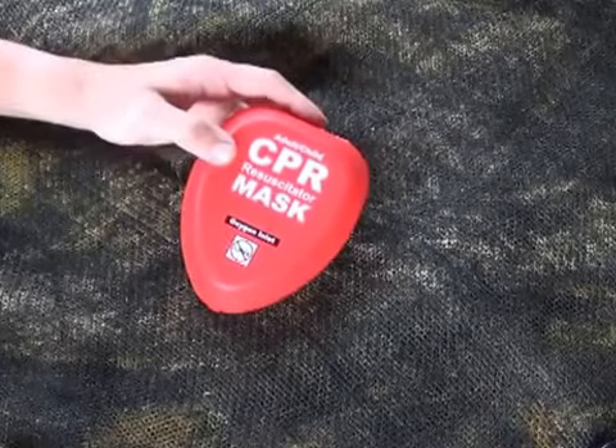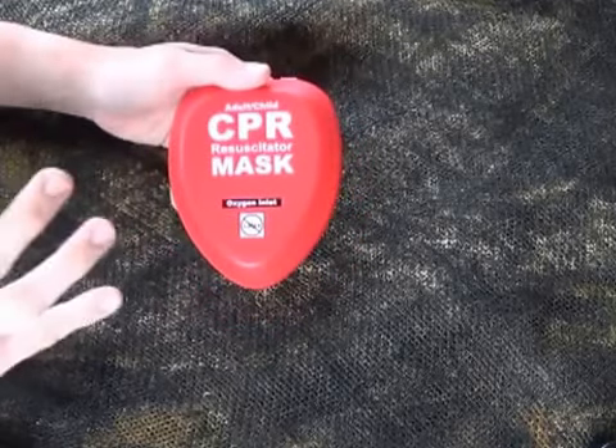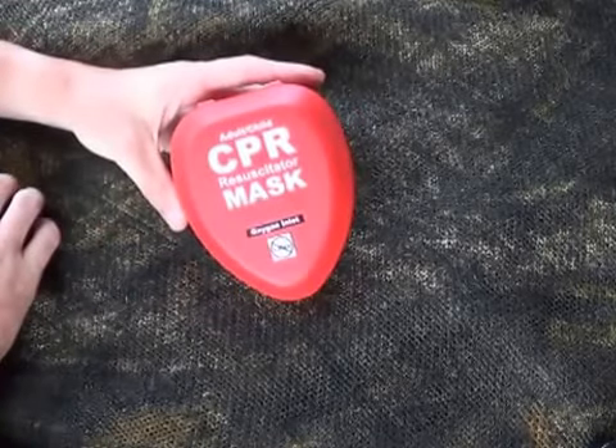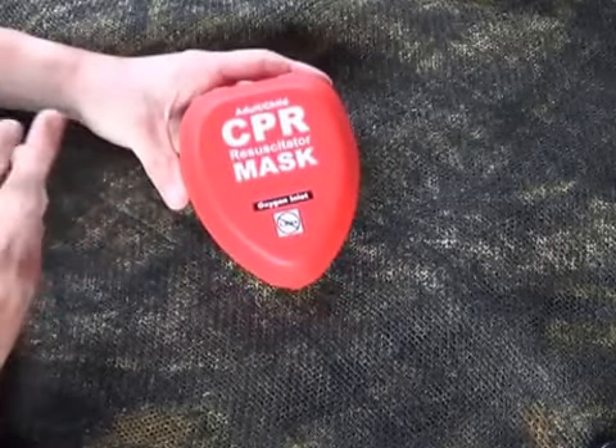Hey YouTube, welcome to another video from Skinny Medic. I just want to do a quick video on what a hard face mask for CPR looks like. I know you've seen them around different stores, may have seen them on the internet, so I want to do a quick video on what it actually looks like and how to assemble it.